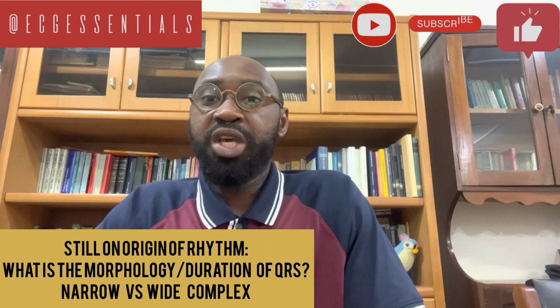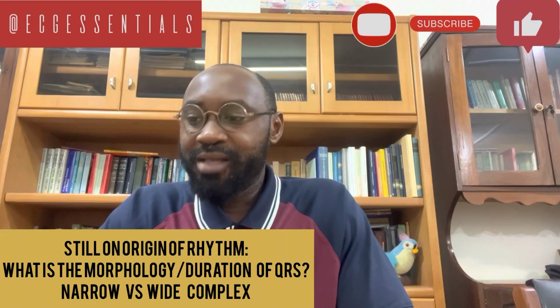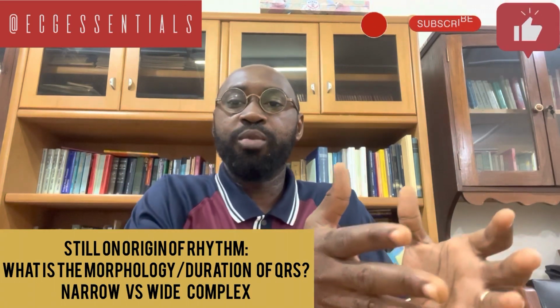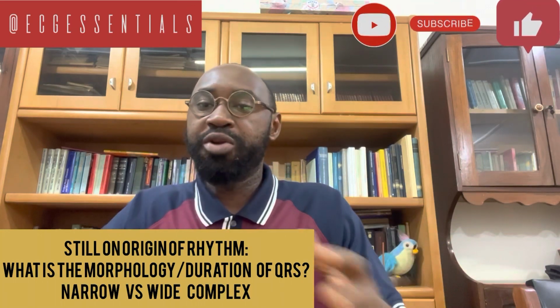So as we have just said, in looking at the rhythm, after we have tried to appreciate whether it's regular or irregular, the next thing of interest will be to find out if the P waves are present, and if they are present, how do they look? The other thing that will help us appreciate the origin of the rhythm is the morphology of the QRS complexes. And in simple terms, we see that we have narrow complexes, and then we have wide QRS complexes.